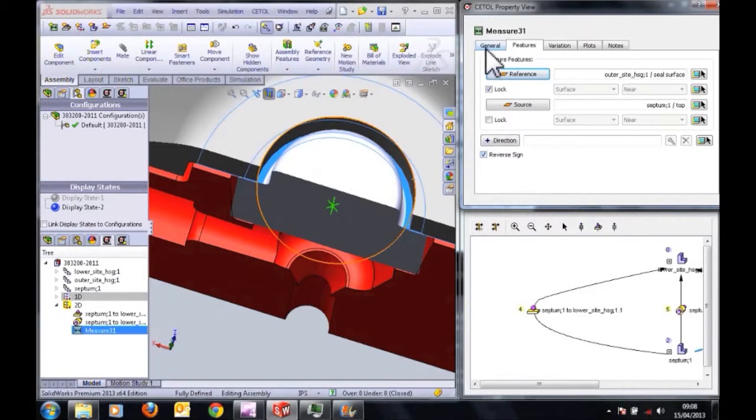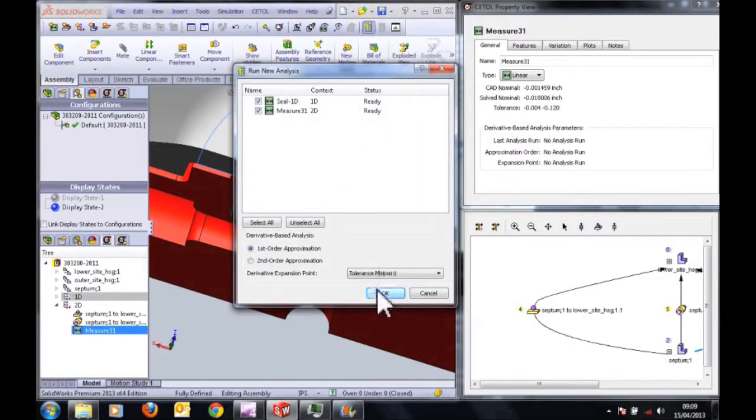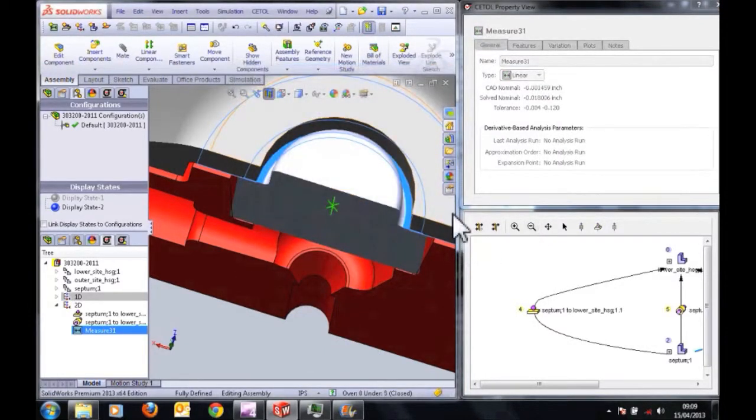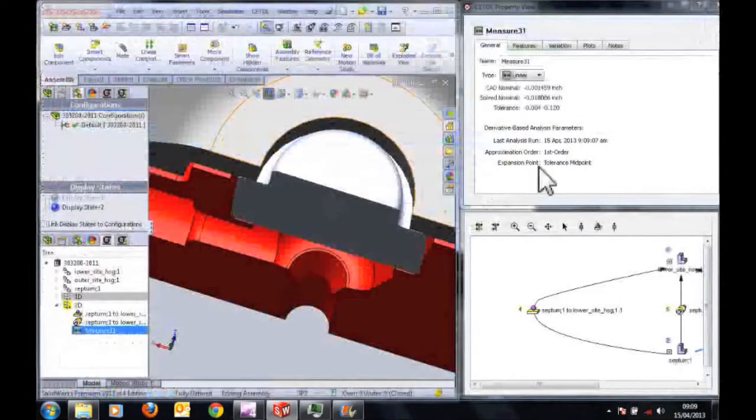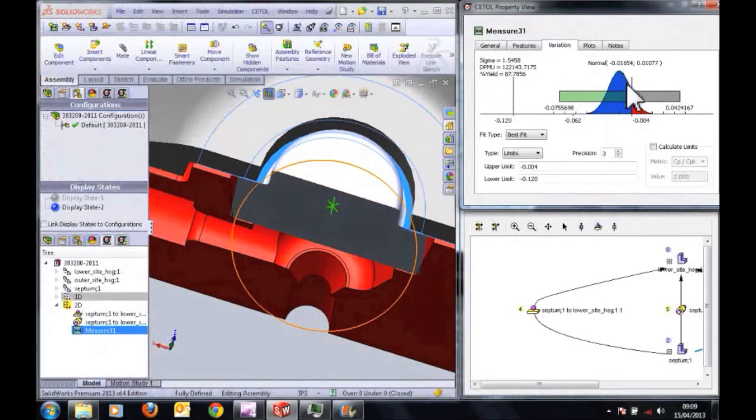I want a negative value, so I'll just reverse the sign, and now we can see here the CAD nominal, the overlap as the parts were positioned by the CAD package is this, as positioned by CTOL is this. You can see they're not the same thing. CTOL is actually calculating for real the overlap based on the mechanical contact between those surfaces. Now if I do the analysis, you can see it runs very, very quickly. I will be able to see at a glance then, if I make a large number of these components, the red region of this curve is the proportion of the manufactured components that fail to maintain that seal condition based on the variability that I've defined in my process.